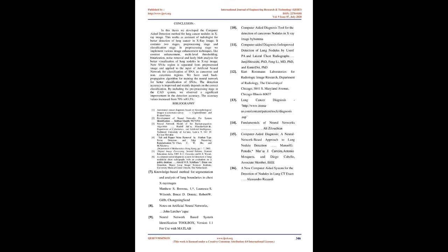Method 2. In this method we calculate the area and perimeter of each blob and then calculate the following parameter. If any blob for which both parameters, ratio and compactness, are less than 0.5, we eliminate that blob by setting all pixels of that blob to the background value, 0. The image obtained after blob analysis acts as a mask, which is projected onto the original input image. Compactness equals 4π area over perimeter squared. Block diagram of blob analysis of binary image.